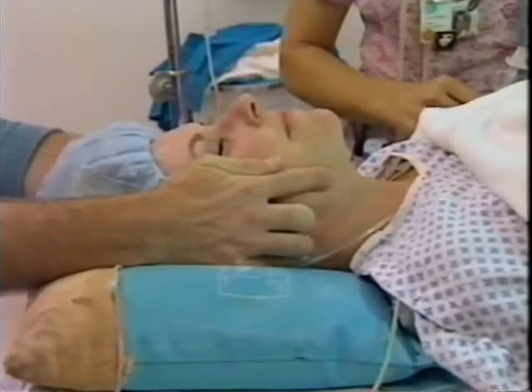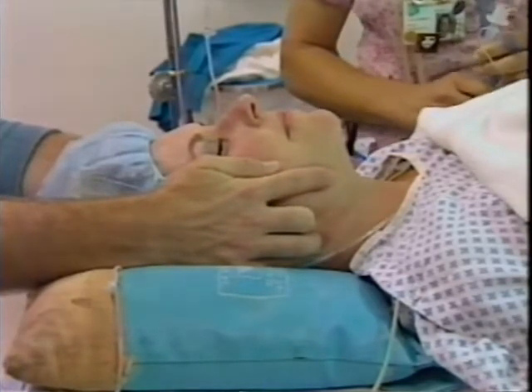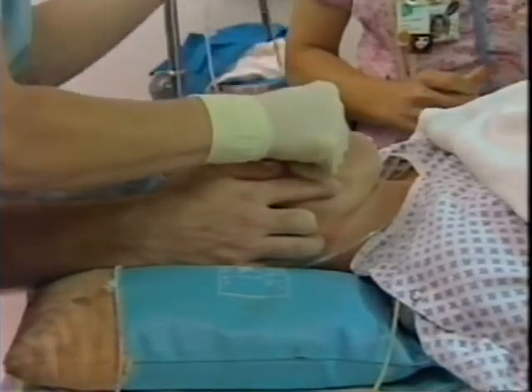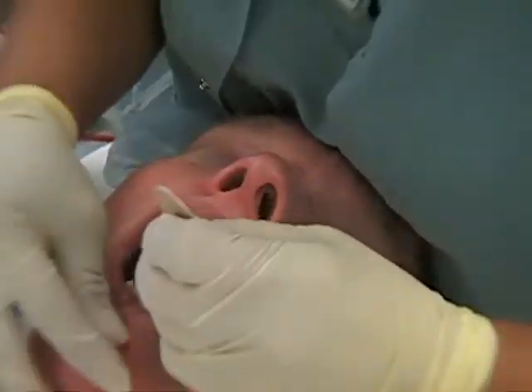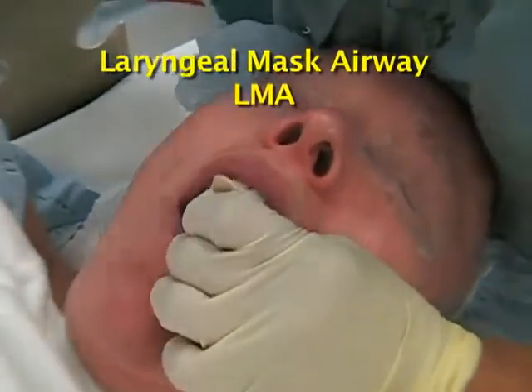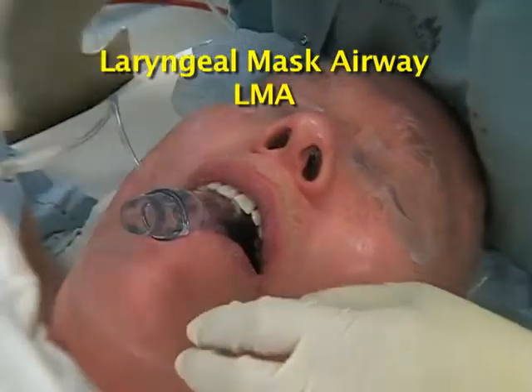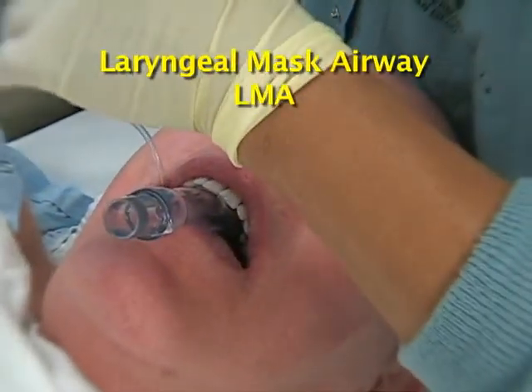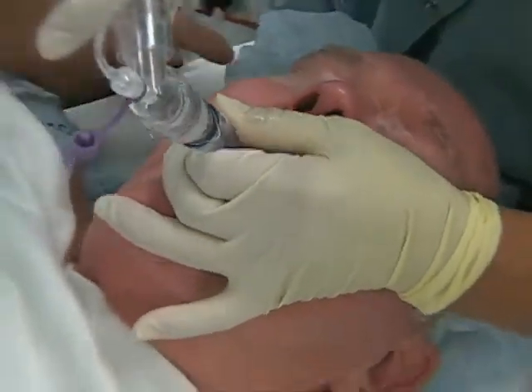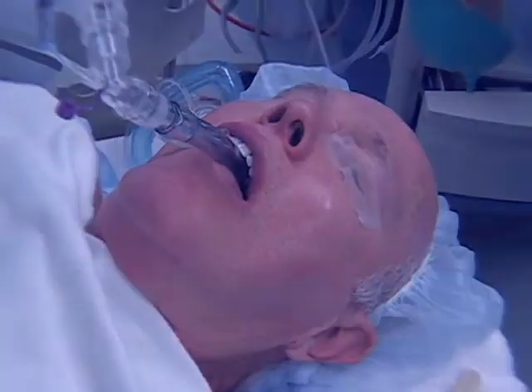Gentle cricoid pressure may help, but this must be used as a last resort and with caution to avoid potentially displacing any cervical vertebrae. If you can't intubate easily, then ventilate using a mask or a laryngeal mask airway or an esophageal obturator airway until advanced airway techniques are available. In the can't intubate, can't ventilate scenario, emergency cricothyrotomy may be the fastest and safest means of securing the airway.